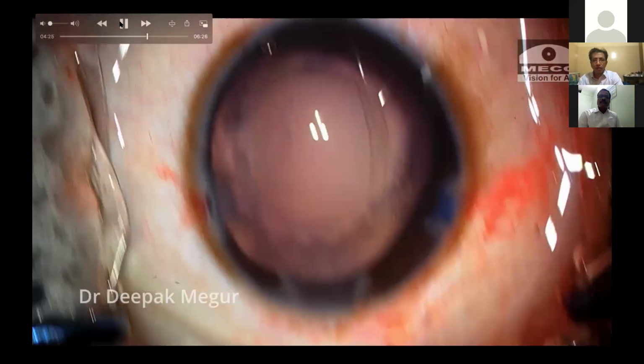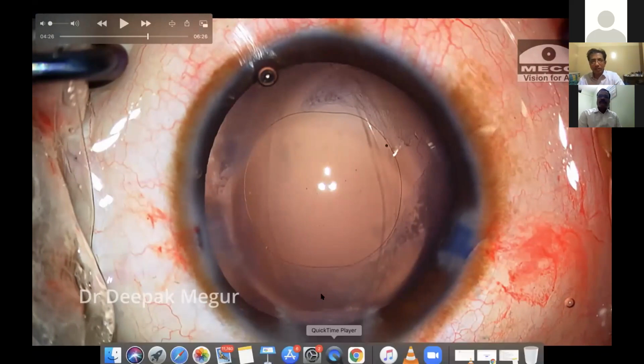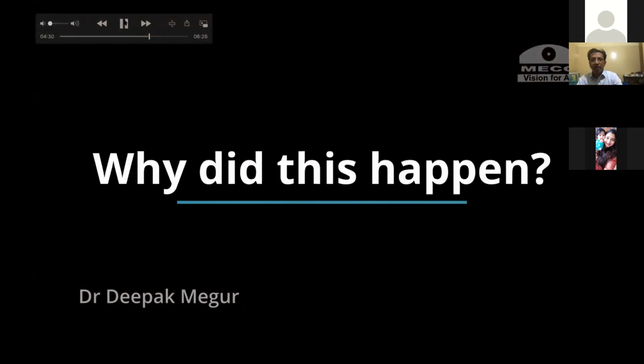Now, lo and behold, no, the PC was perfectly fine. I injected viscoelastic. Now you can see the vertically split posterior capsule here, again, equator to equator. The way this splits is usually classical of a polar cataract. And this was extremely surprising for me. You never take anything for granted.